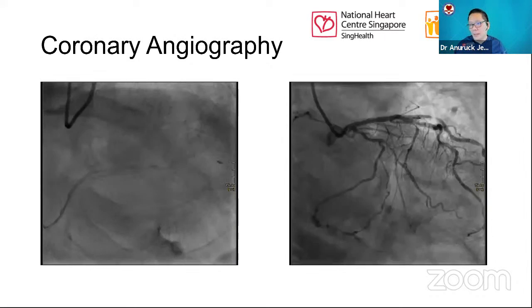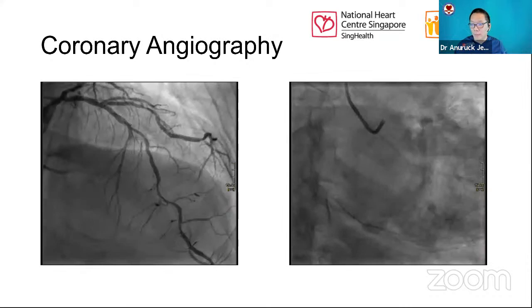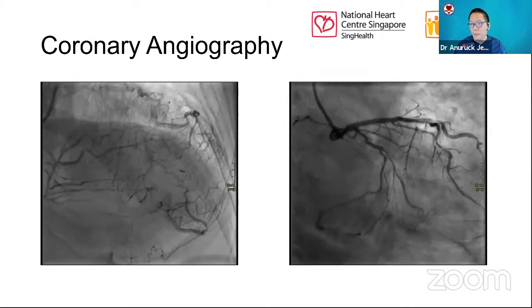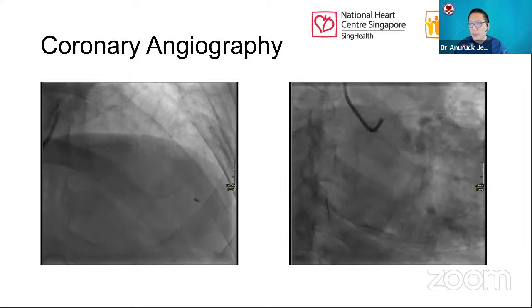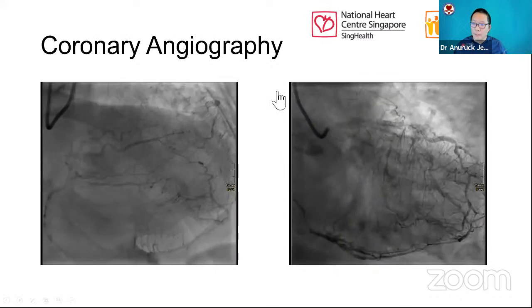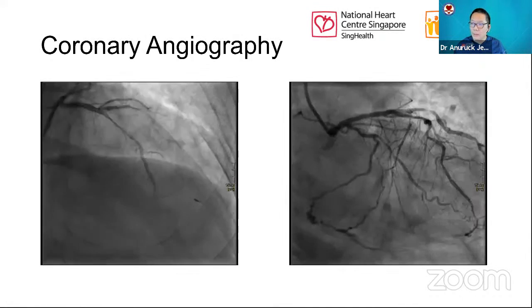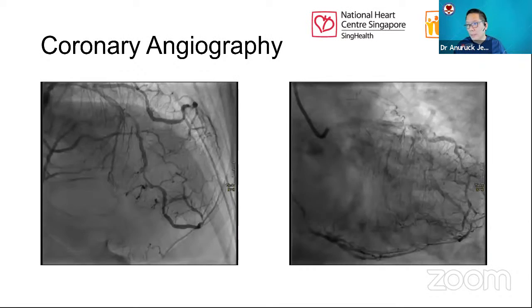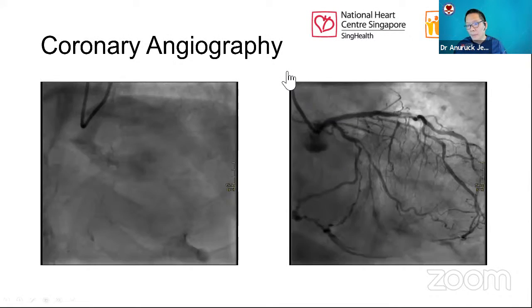Sure, because I think OCT will give us a lot of information about the landing zone. Because it's a diffuse disease, it's very difficult to find the normal tissue around this area. And the second thing is it's quite a calcified lesion. So I'd love to see the OCT to do the stent pre-planning and optimization.